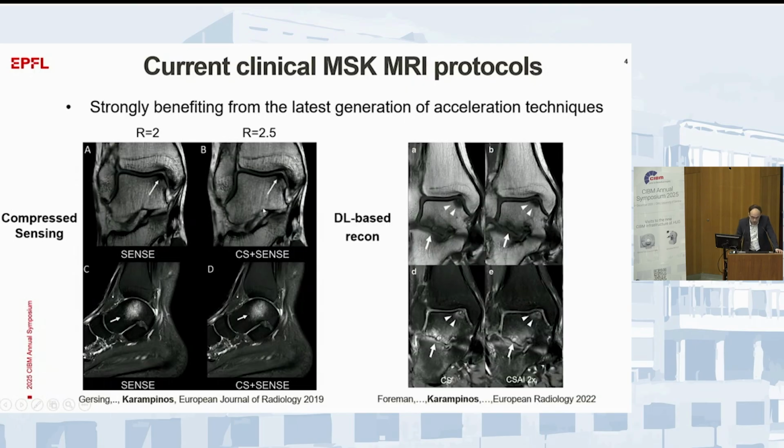On the other hand, over the recent years, and this has happened quite more rapidly, as you see, these are the papers that we had in Munich when we first got this software, so I basically helped the radiologists do this evaluation. We have here a deep learning-based reconstruction using a more advanced regularizer, using deep learning, and going from an R equal to 2.5 to 5.1.